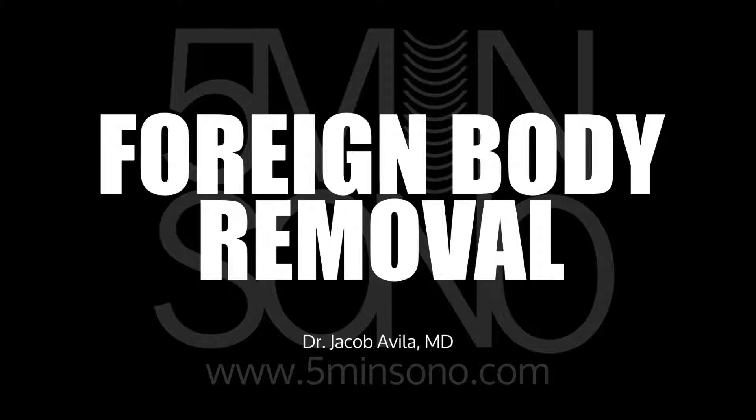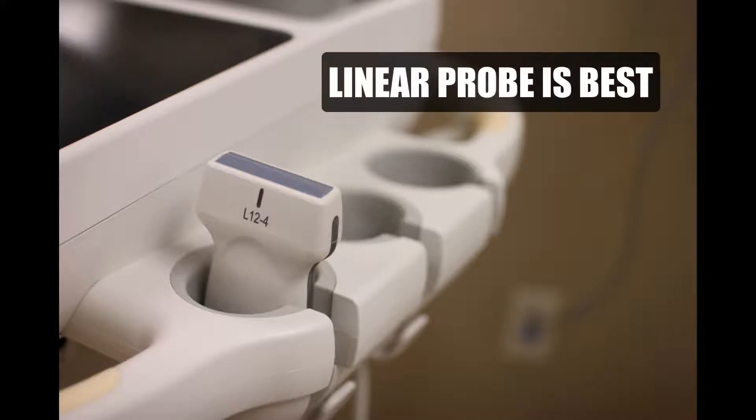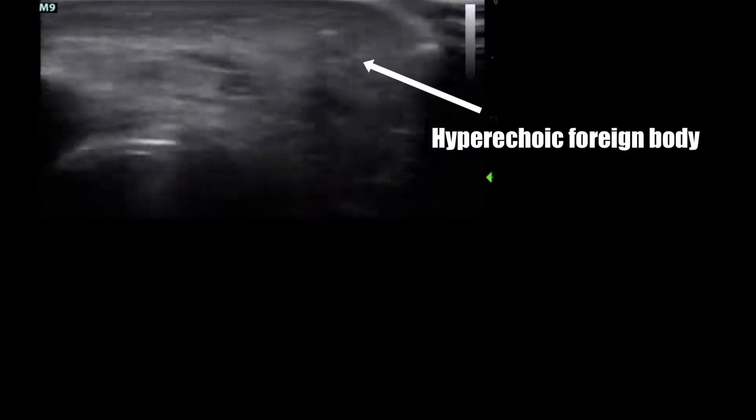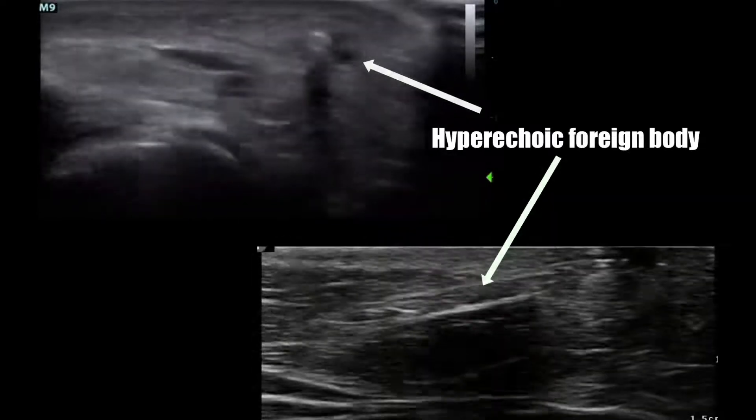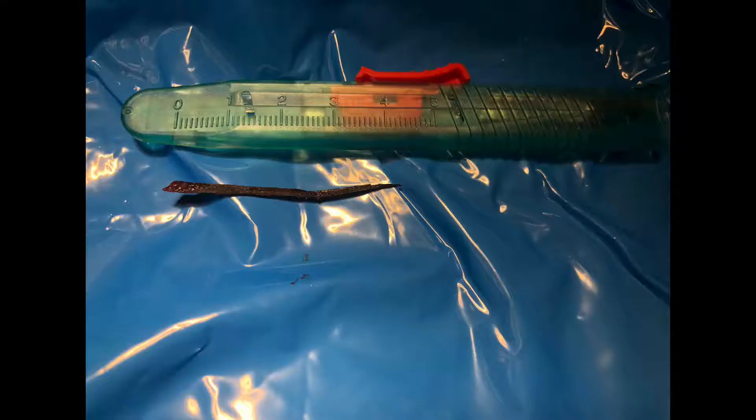The first step is going to be to find that foreign body. If you have a patient in which you suspect they have something underneath their skin, stick that ultrasound transducer over that area where you think it is and look for any kind of hyperechoic structure that's not supposed to be in there. Most of the time if it's inorganic material it's going to be very bright, and even some organic material such as wood and splinters is going to be pretty easy to find under ultrasound guidance.